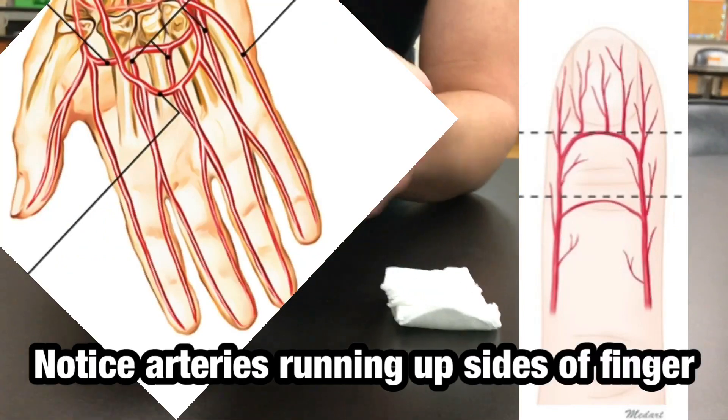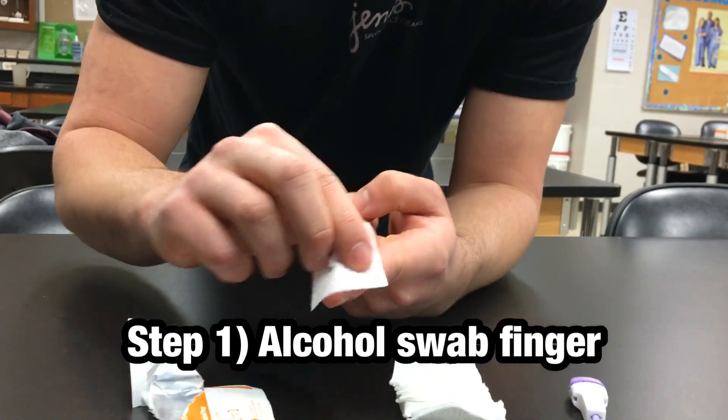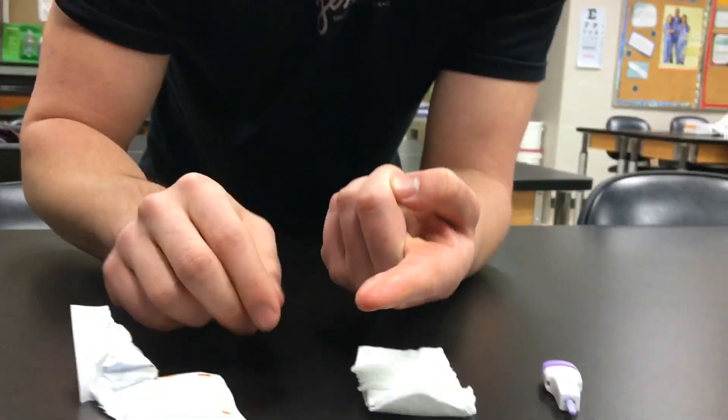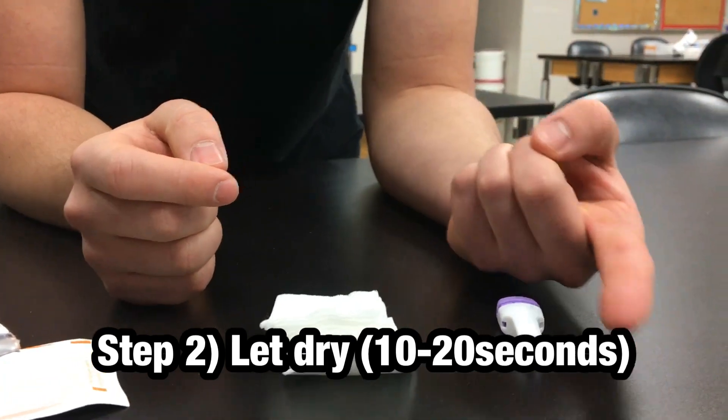Before we do that, we're going to take our gauze and we're going to wipe our finger. Whichever one you plan on pricking, make sure you wipe it, sanitizing it, and now we've got to let it dry. If we don't let it dry, it'll kind of contaminate the sample.